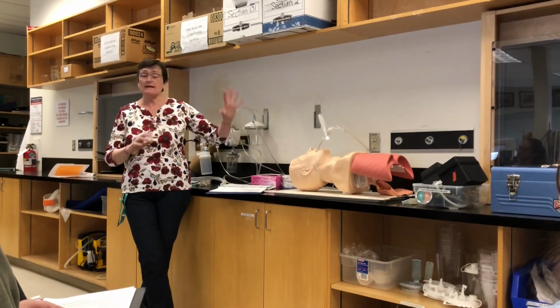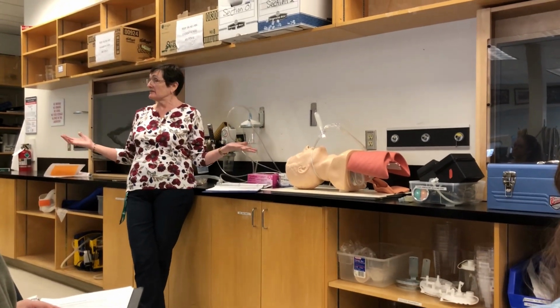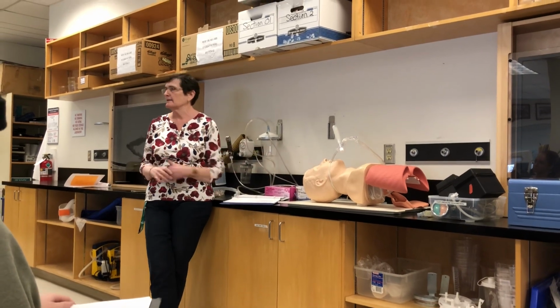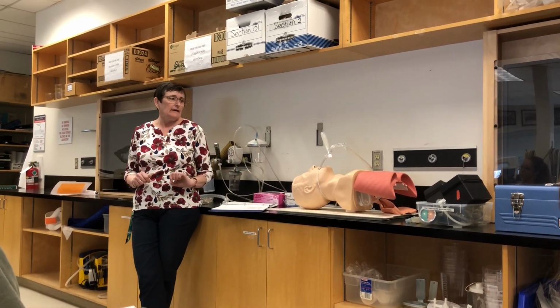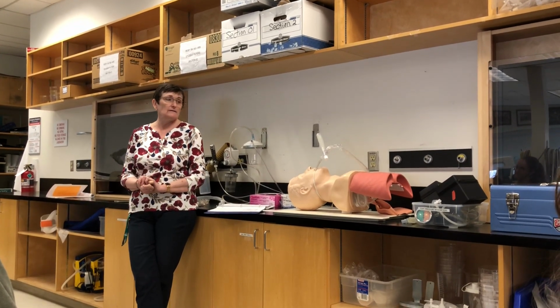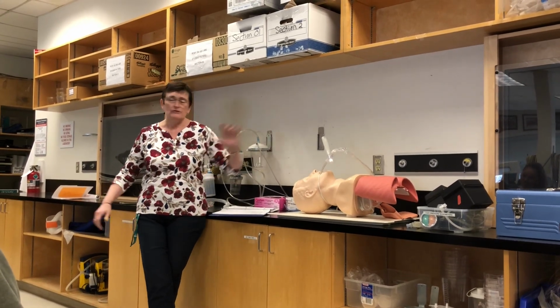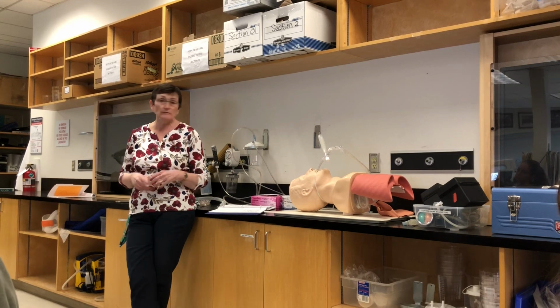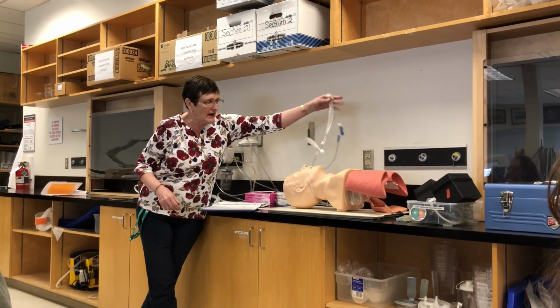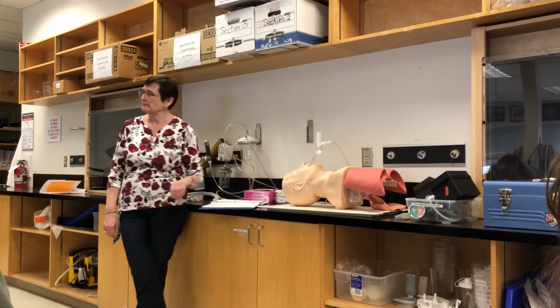But if this was a fella, let's say he was on the ventilator for a period of time, it hasn't been 5 to 7 days, which is what we usually wait before we do a tracheostomy. He's doing great. Gases are excellent. He's on pressure support right now. Volumes are great. Cuff leak, yes, there is a difference between inspiration and expiration on cuff leak. So I'm not too concerned about there being any swelling, but be prepared anyway. Okay, so we've still got his suction attached. So we've got closed suction, and this is the attachment to the ventilator at this stage.